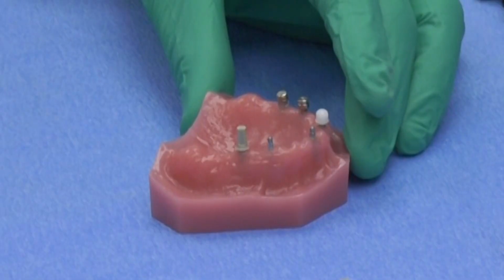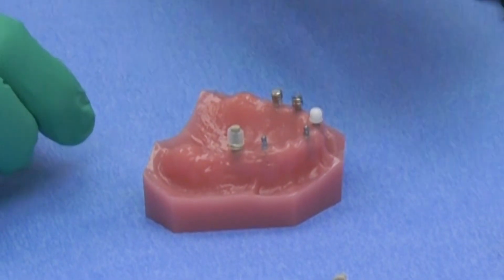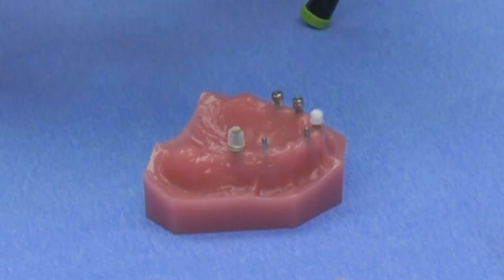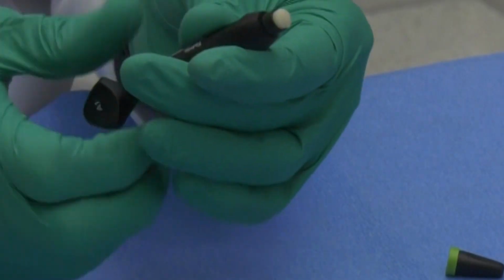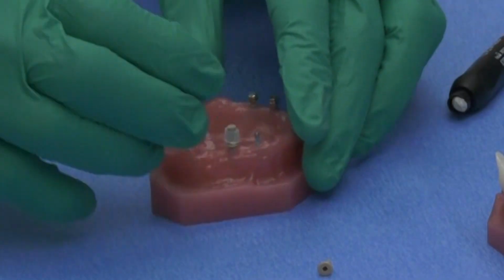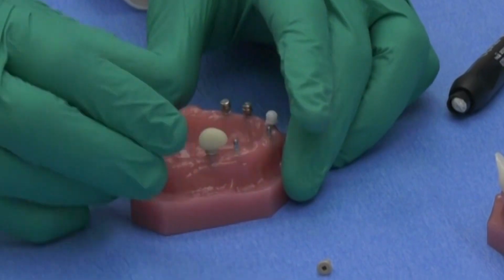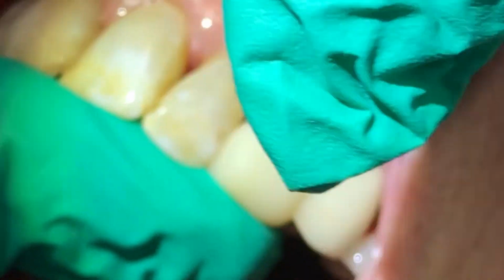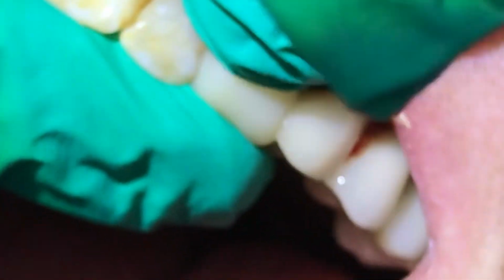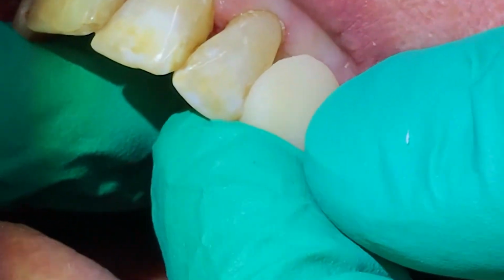So what we do to temporize these is we place a large one-piece shim over the top of the TrueLock abutment after you prep it, or if you leave it the same way it is, and then we pancake composite filling material over the top of the shim and the implant. And you shape the tooth to look like, if it's number 9, to make it look like number 9, and polish it up, check the occlusion, and that's all you need to do.